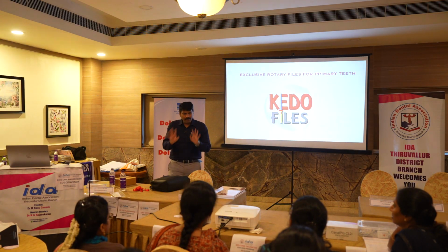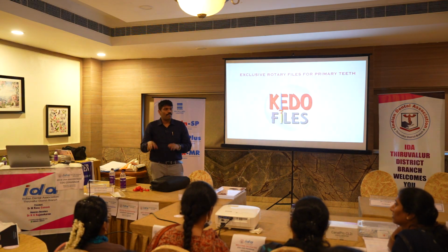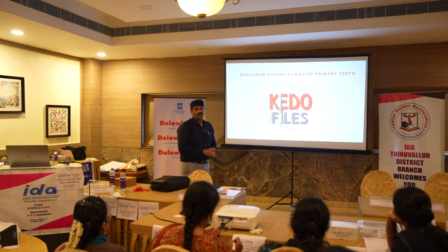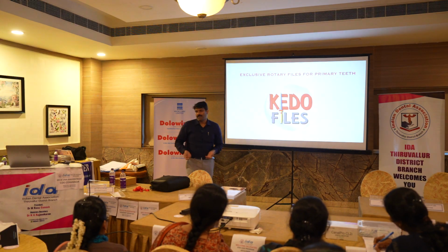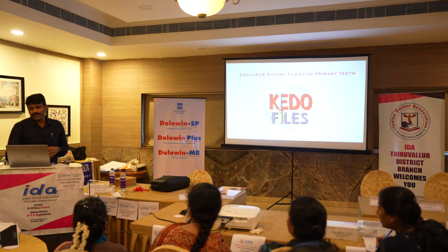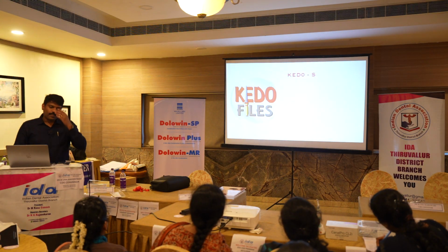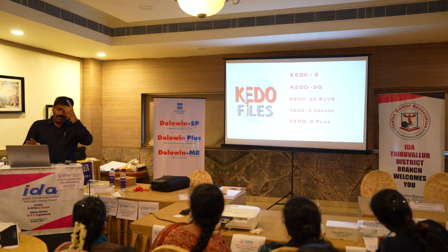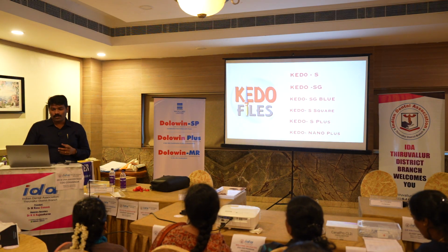No, in primary it is swiping motion. Manufacturer's recommendation for the rotary file or the hand file is swiping motion. Ideally speaking, control memory files are to be used in swiping motion. Control memory, I'll tell you what is control memory files. Okay? The hand files are done. Next will be your pediatric rotary file. There are so many generations in pediatric rotary file. I will let you know what exactly it is, one second.